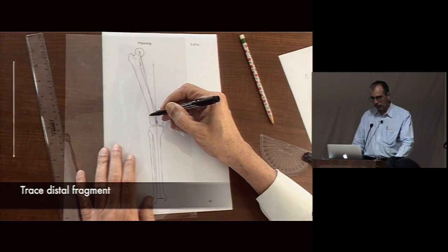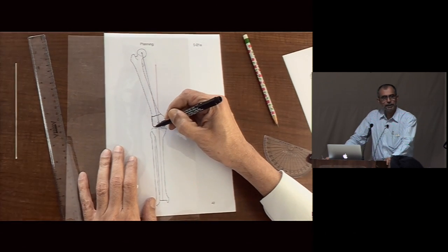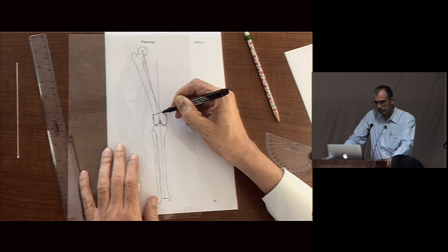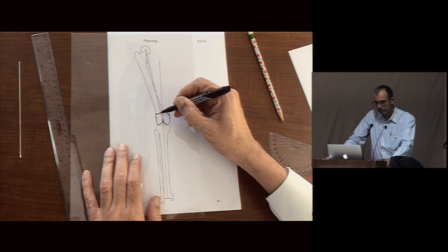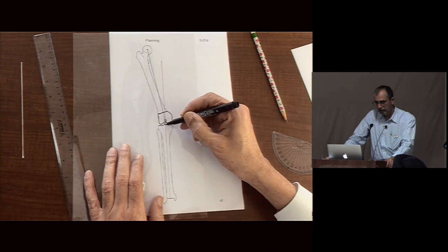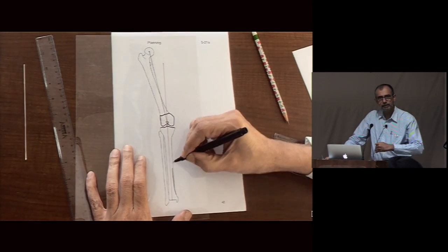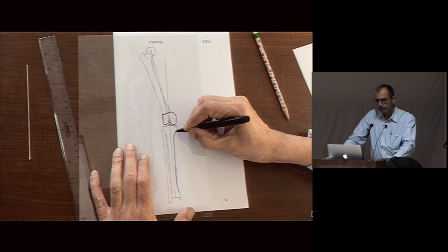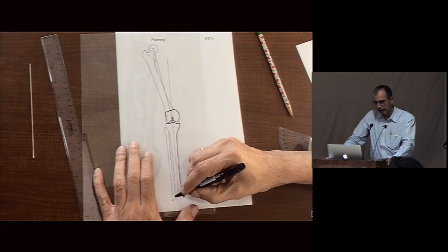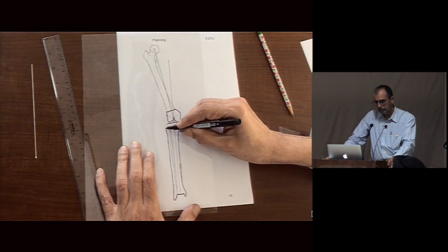So same thing, what we are doing now is drawing the distal fragment, drawing the distal axis. I have already done the planning on the paper, now I am just transferring the osteotomy and the distal fragment onto the OHP.